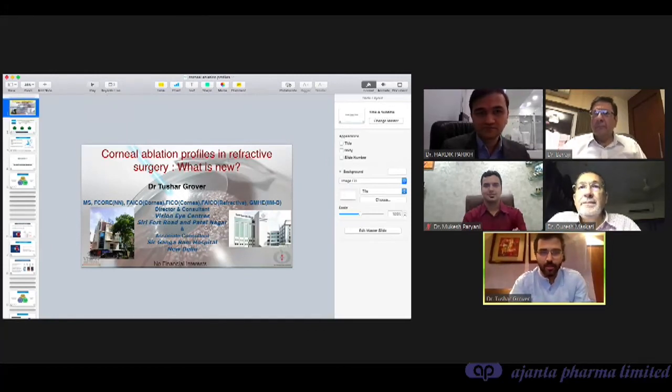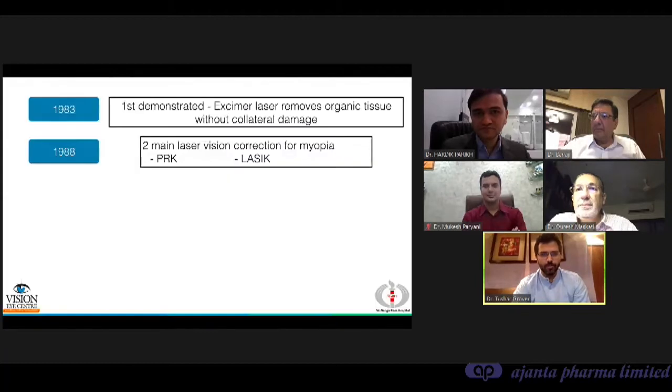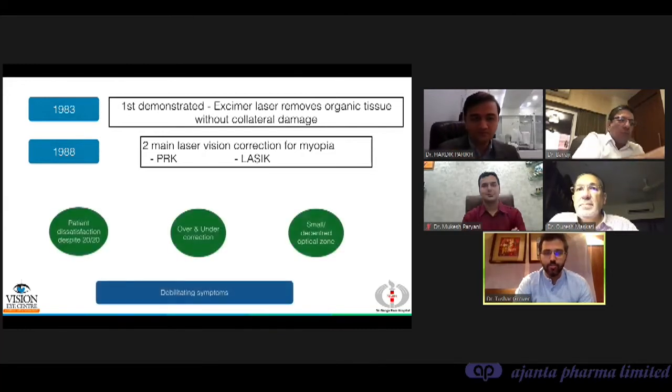webinar. So I'll be talking about the ablation profiles that we have today in refractive surgery and how they are different. So as we know, LASIK and PRK have been around for decades now, but the issue with the original ablation profiles, even though they were able to correct refractive errors adequately, was the induction of aberrations. And Dr. Mukesh also stressed on the importance of aberrations that exist in the eyes and how worsening of aberrations can really hamper the quality of vision. So this is what was happening originally as well. And a lot of these symptoms were intolerable to patients.